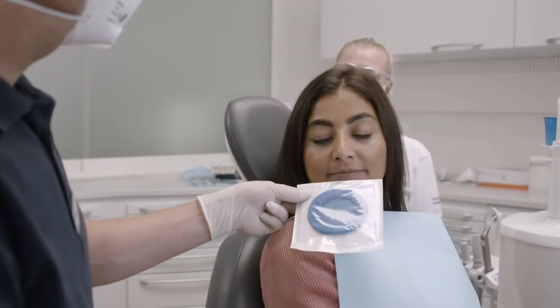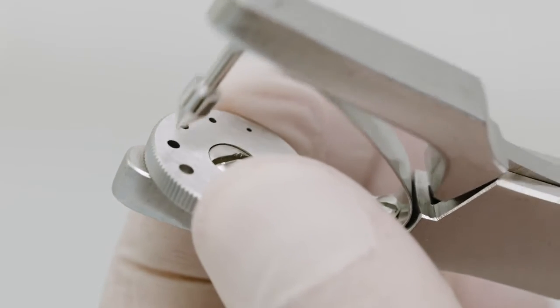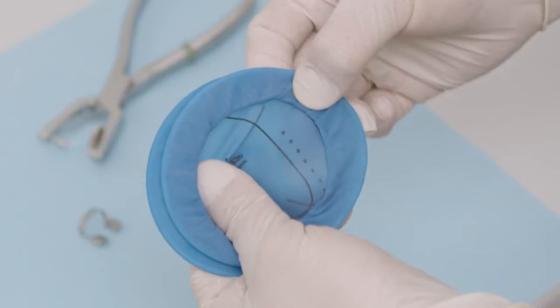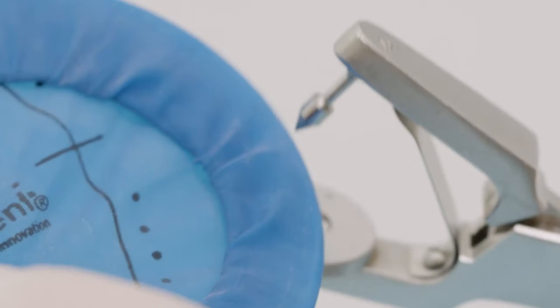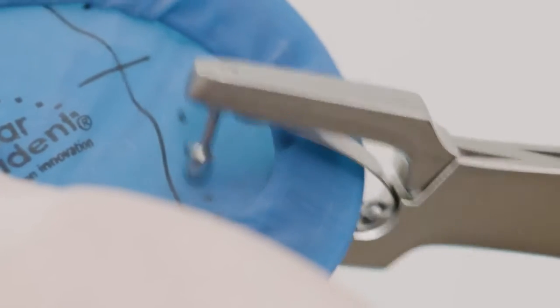Select the suitable size of Optradam before the treatment. The rubber dam punch is used to make the appropriate holes depending on the teeth to be exposed. Optradam has markings on its surface to facilitate the perforation.